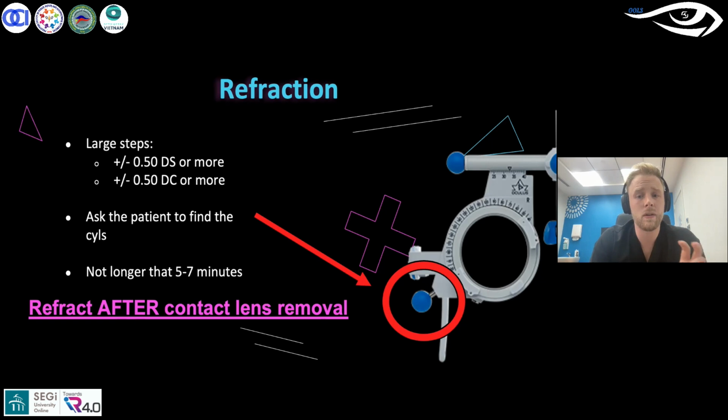Scleral lenses with adequate vault tend to be less prone to inducing this blur post-removal. But again, if you're sorting out contact lenses and glasses, get the contact lenses sorted first and then review the glasses afterwards if they're going to be a consistent lens wearer.